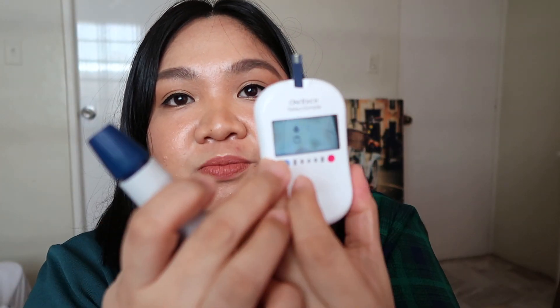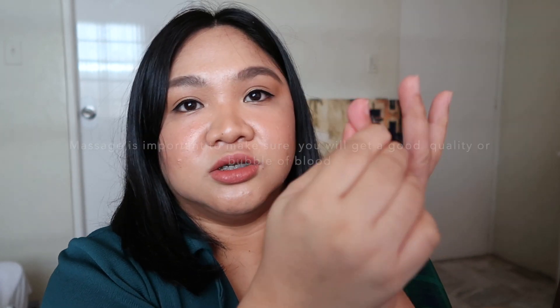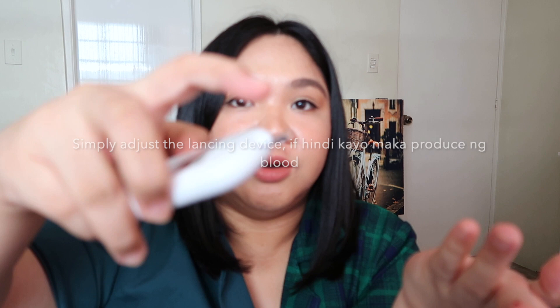Once the ready icon appears, it's time to puncture. I usually do the tip of the finger, rotating fingers each time. For today, we'll use the ring finger. Make sure you massage your hand from here to here to circulate the blood. Once you're ready, puncture at the softest part.